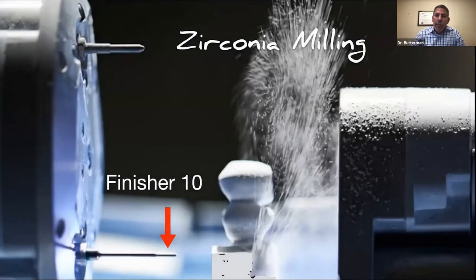But let me just jump in. I'm going to back up just a little bit from where Kat was talking. Why zirconia? When zirconia first came out on the CEREC side, the very first zirconia that we had available, that some of you might have used, is CEREC zirconia. So what Dentsply Sirona did was they took a bunch of beta testers and brought us out to Germany to show us this zirconia. And we milled it. And if anybody's ever used CEREC zirconia, it's really opaque. I mean, it's almost embarrassing to place it in the patient's mouth.